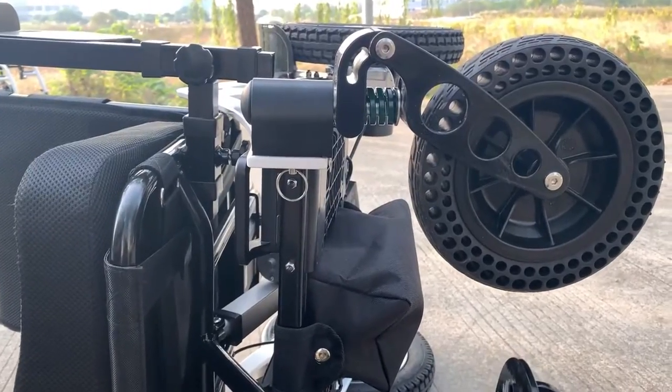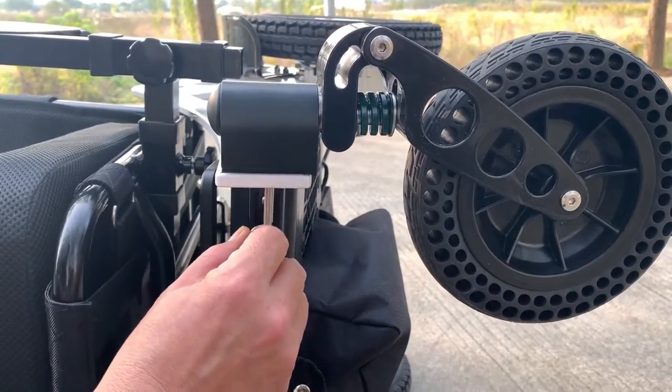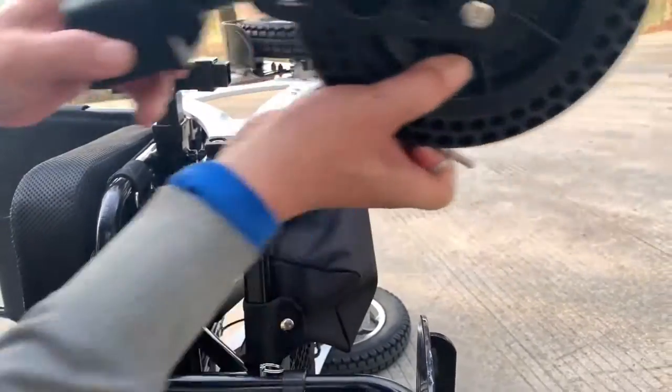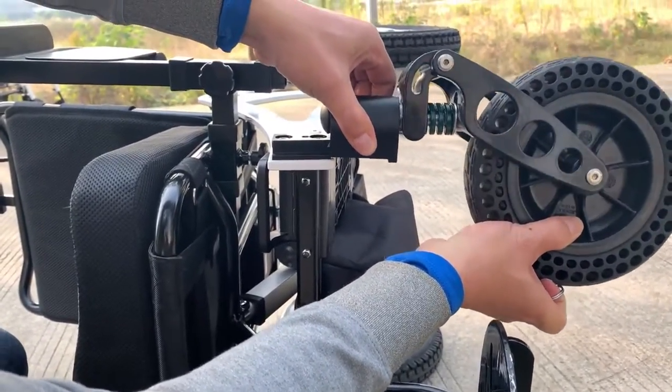Apart from dual suspension on the front wheel, we have a pin that you can pull out and the wheel can be easily taken away. You can just slide it in to assemble. Simple and easy.